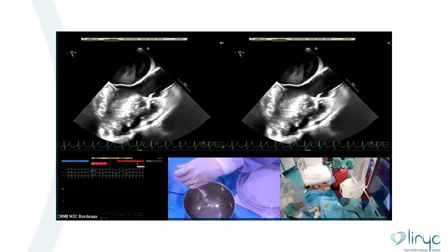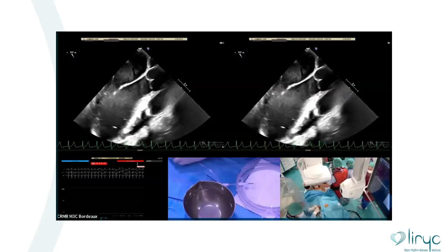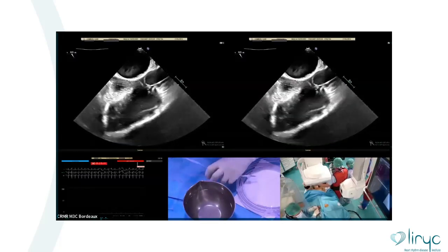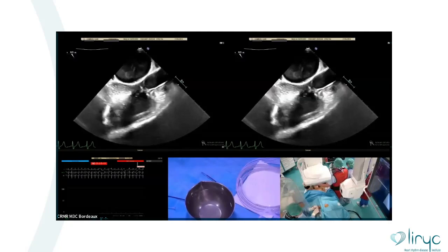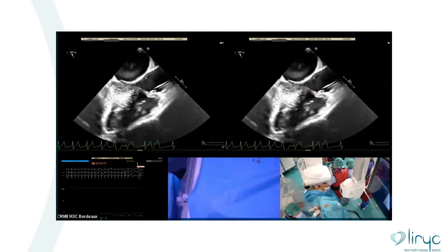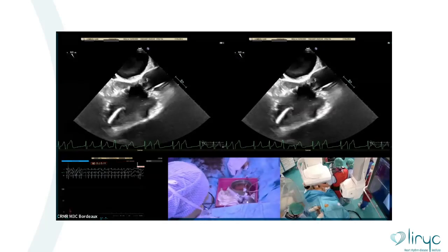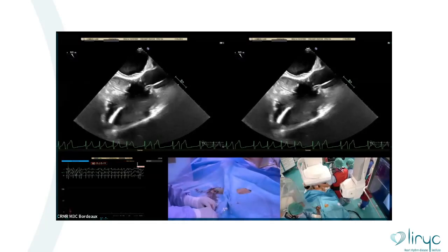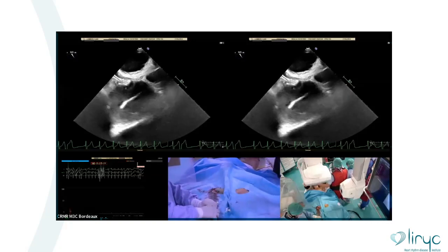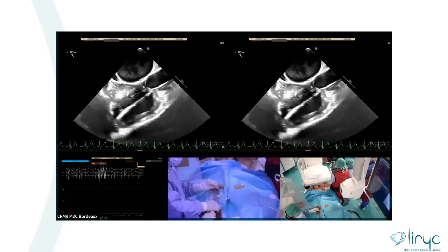Go ahead, the delivery system. Attention, Sophie. Go ahead. Haven't aligned. Yeah, we have passed, right? That's the good position, going down to the apex, okay? You haven't reached. You need to advance more, JB. Okay, yes, good job. That's good. It will be protected.